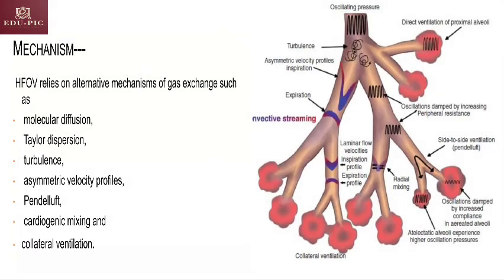And here are some theories about how high frequency oscillatory ventilation works. You can say molecular diffusion, Taylor dispersion, turbulence, asymmetric velocity profile, pendelluft, cardiogenic mixing, and collateral ventilation.